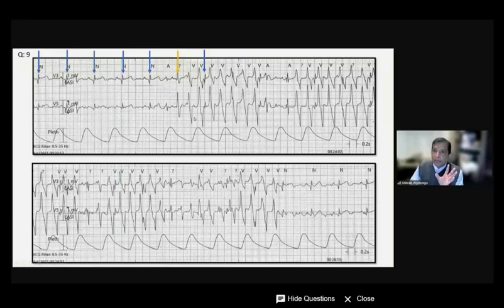But you can keep marching them out. This one, I'm not sure because it's inside. But here, now suddenly I see that QRS is identical to that and to that. So I can march them through like that, right? And in the bottom strip, I can't start from the left side. If somebody gave you only the bottom one, you start backwards, because you start with the things you know.